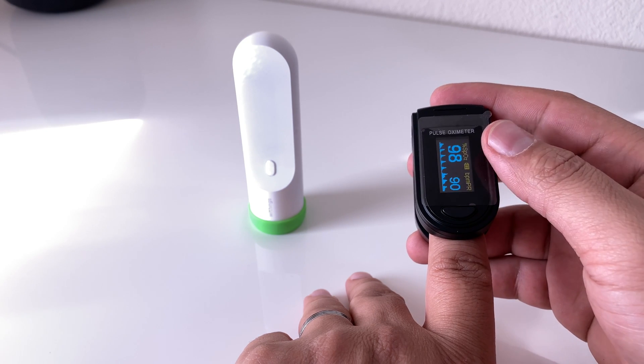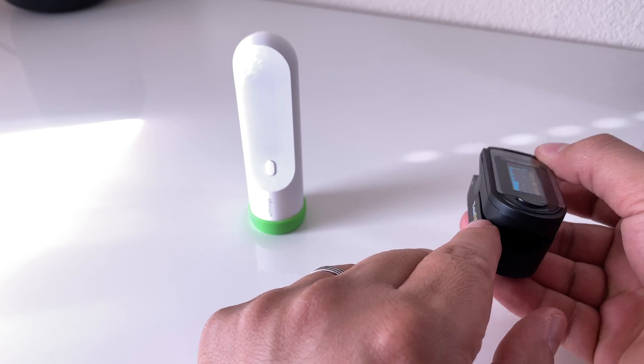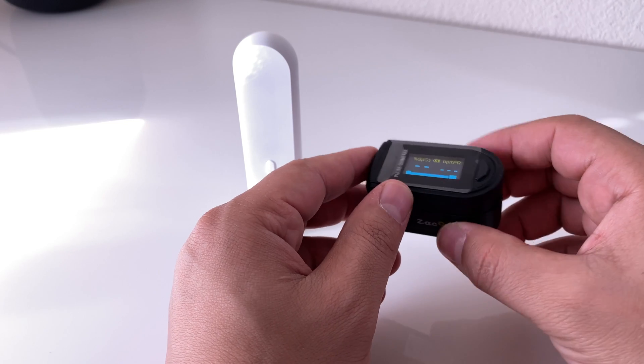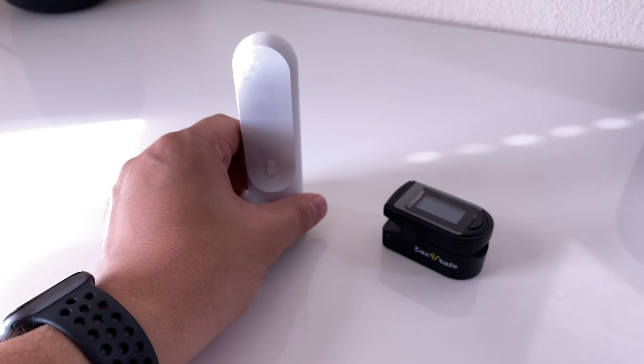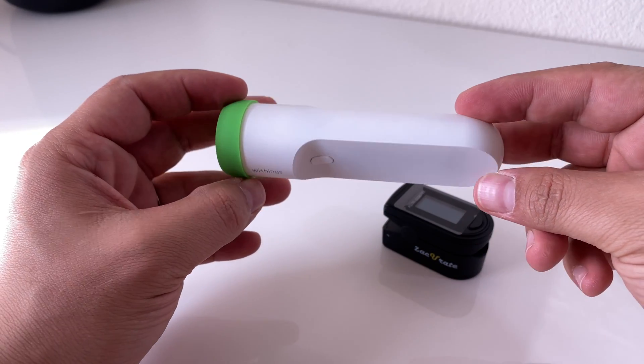I really like this device — it's really affordable, about $14 on Amazon, and really well built. It's a must-have. The next device here is a thermometer, and these are really useful.